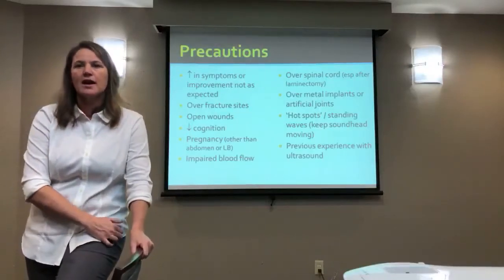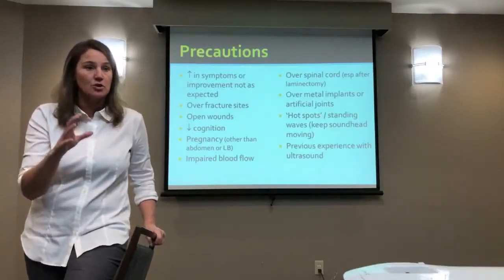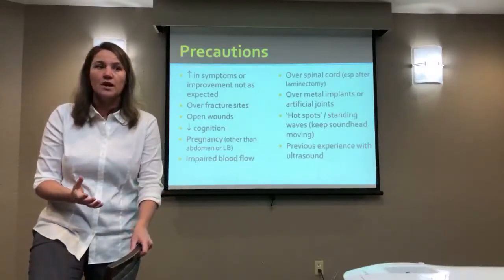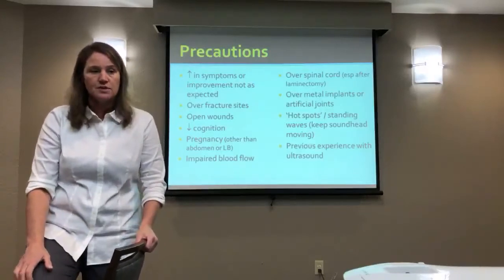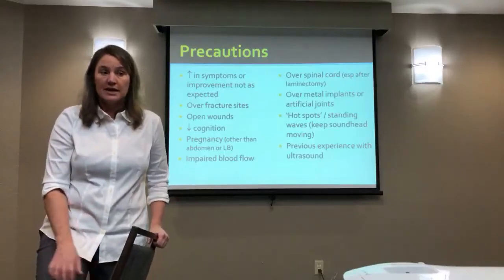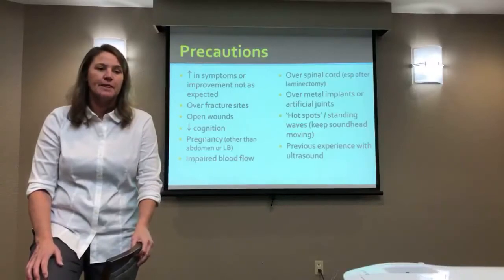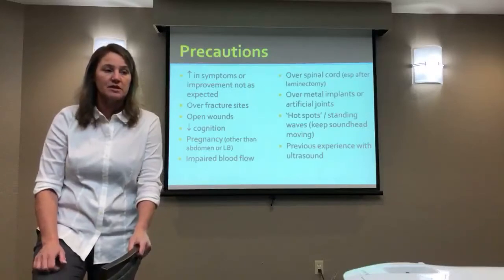So if you had a patient who had a fracture and you want to do ultrasound in that region, it's not contraindicated. I'm not sure why you would do it if it's not for the purpose of bone stimulation, but it's not contraindicated. I would just be cautious and understand what you're doing and why you're doing it. Open wounds. So actually ultrasound in various forms is used specifically for the purpose of stimulating healing. Right now it's really moved towards low frequency ultrasound, and it's being pretty heavily promoted from a marketing perspective. But it is used, and there is a fairly good amount of evidence on the websites of these companies.